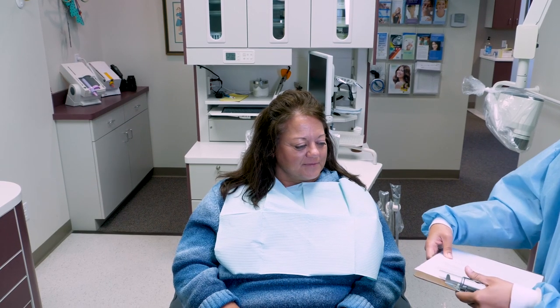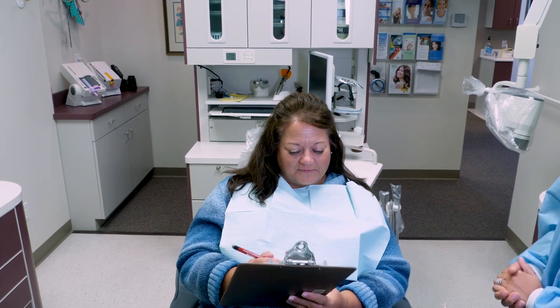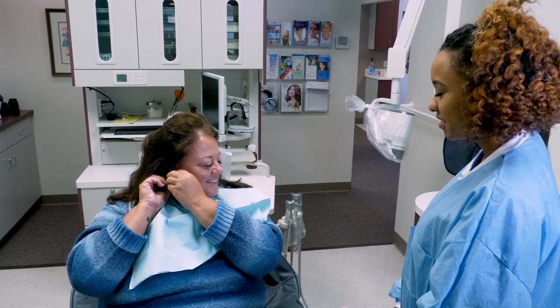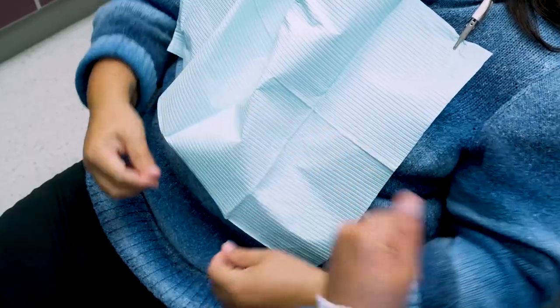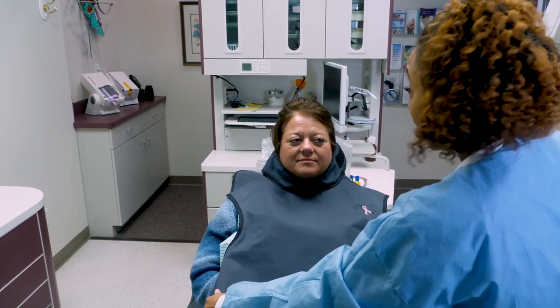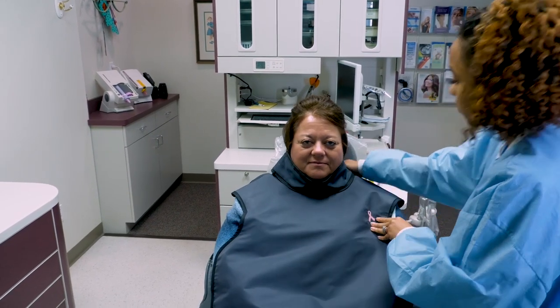Explain the procedure, including risks and benefits of dental radiographs. Obtain informed consent. Instruct the patient to remove any metal objects from the neck up that will interfere with the radiography procedure. Drape the patient with a lead apron, securing the thyroid collar around the neck. Instruct the patient to place their arms and hands underneath the apron.